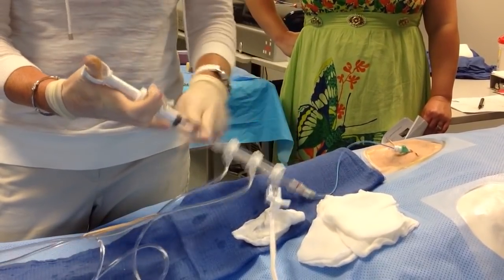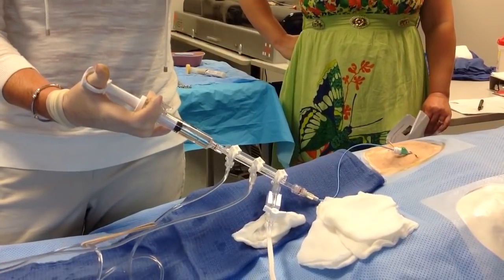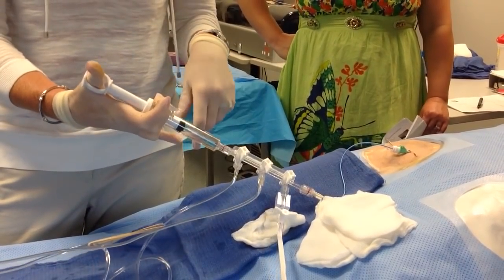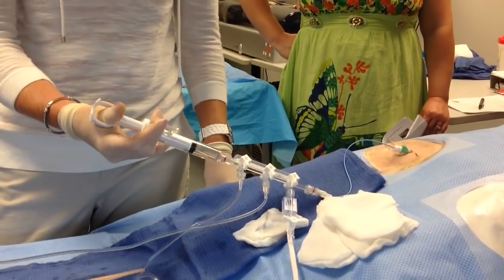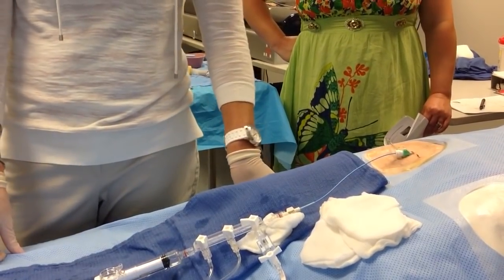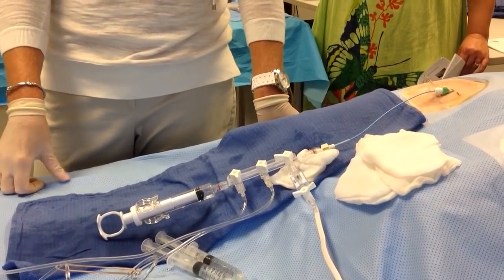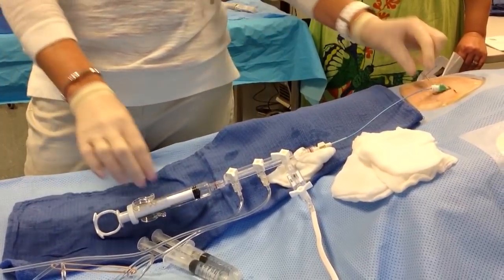And you're going to check pressure first again. It looks good. Your monitor will be right in front of you. Pull back and flush. Back on pressure. And then what? What's the last pressure we have to get? The pullback pressure. Yep, we're going to get the pullback pressure.